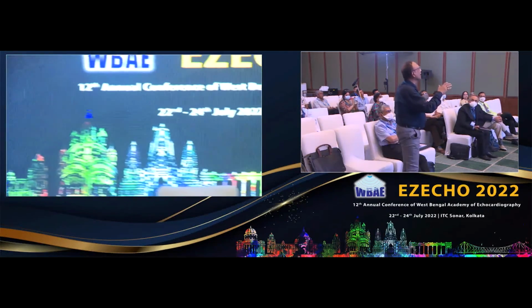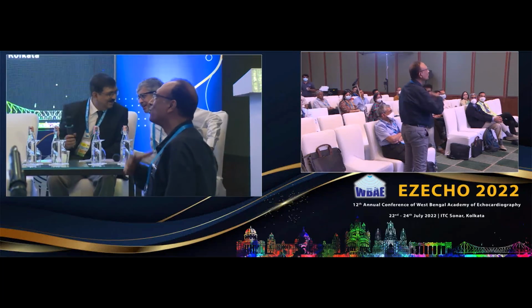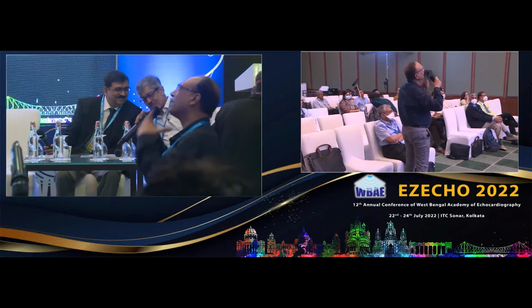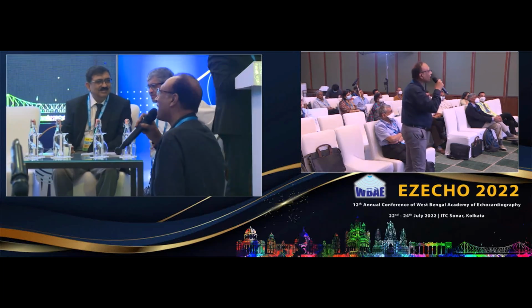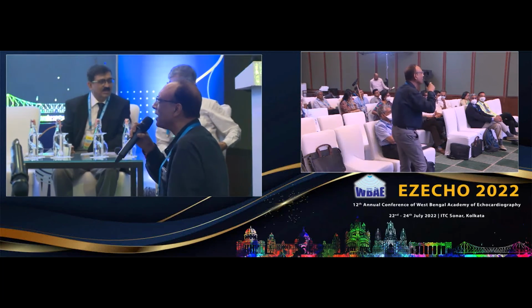Can you ask the companies to have an open lead system, because in MR heart you don't need the brain to be inside. Okay, so if the lead can be open and the head can pop out, many of the problems will go away. So you work with the companies closely. Can you suggest them something like that? Otherwise, cardiac MR will never take up that way.